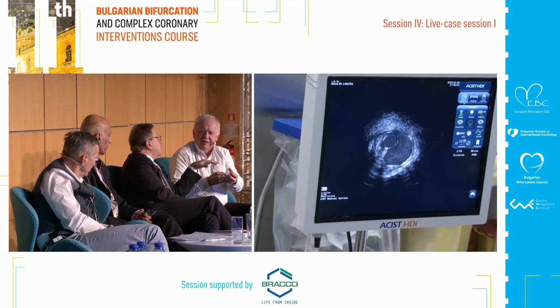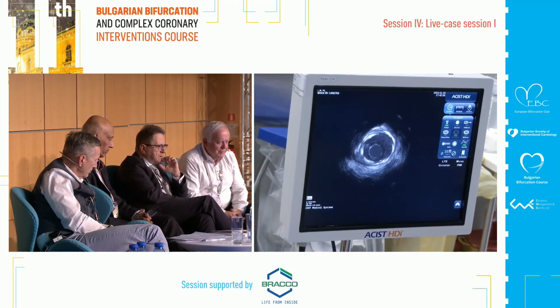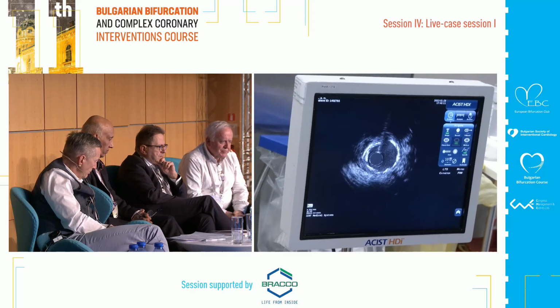With the balloon, it is long, you have to remove. So we need IVUS. I think we can stop here.